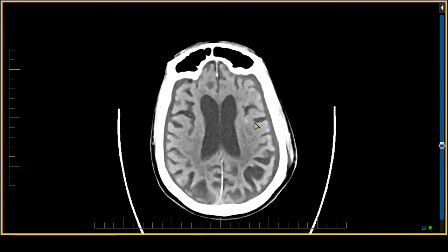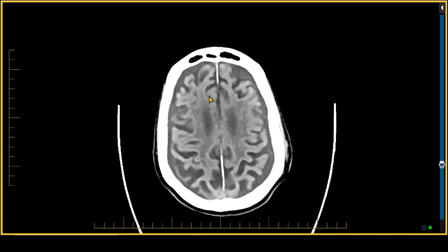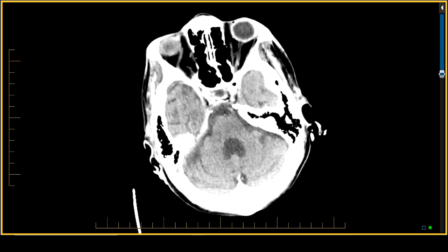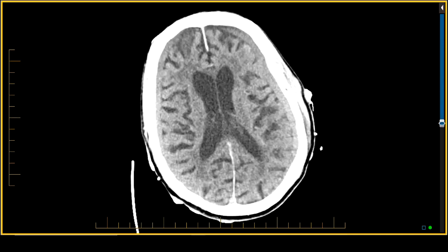The patient deteriorated while in the emergency room. I'd like to show the follow-up study. As you can see by the scout image, the patient is now being monitored with EEG monitors because of the deterioration. And on the CT scan, we can see that those low-density subdural hematomas bilaterally are now isodense.